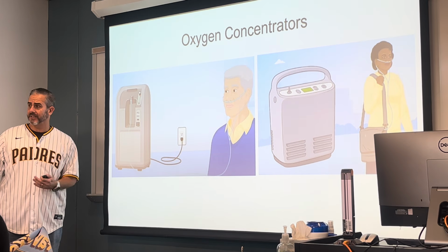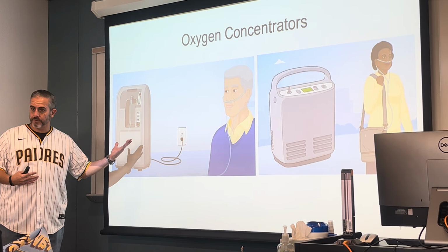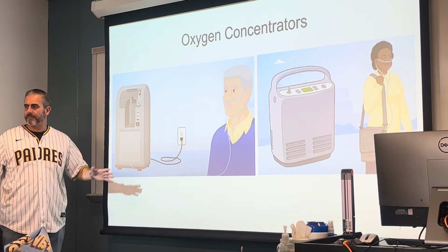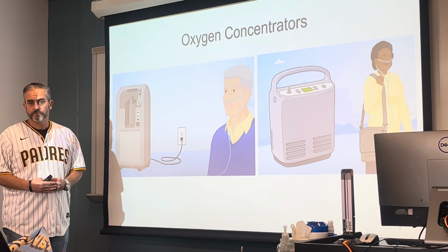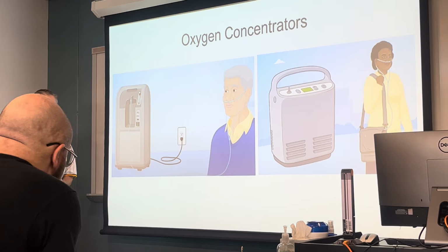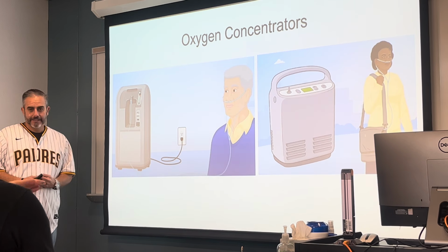But if it's going to be for an extended period of time, or days, again, if the storm was to come through and somebody tries to ride it out, goes, well, okay, I got my backup tank. Again, those tanks aren't going to last forever. So for a concentrator like that, where you had to actually physically plug into the wall, you would probably want a really long cannula if they wanted to work around the house.